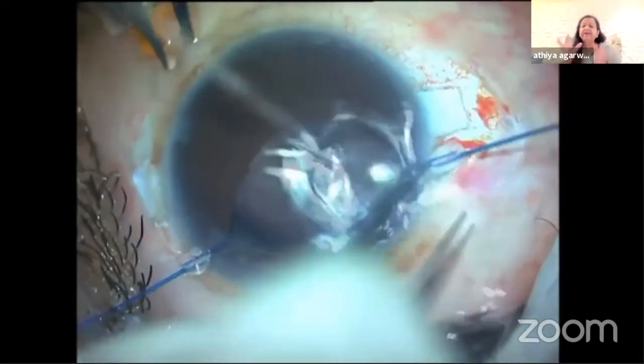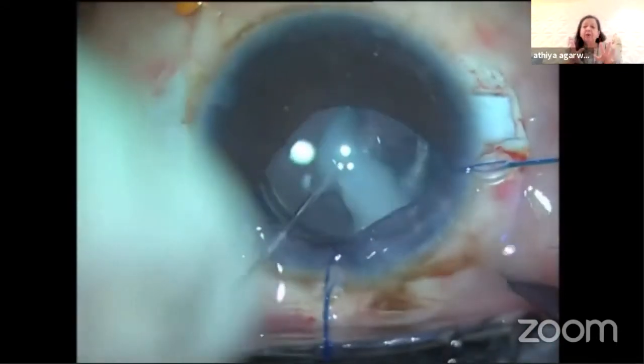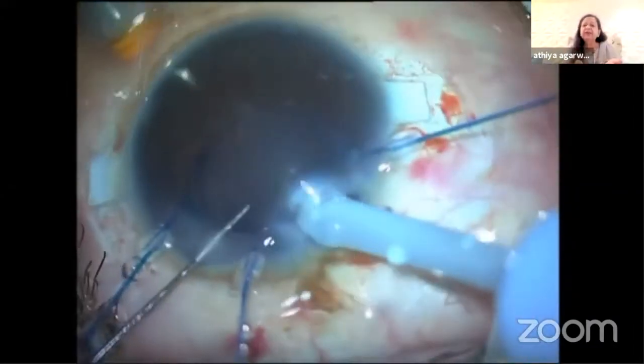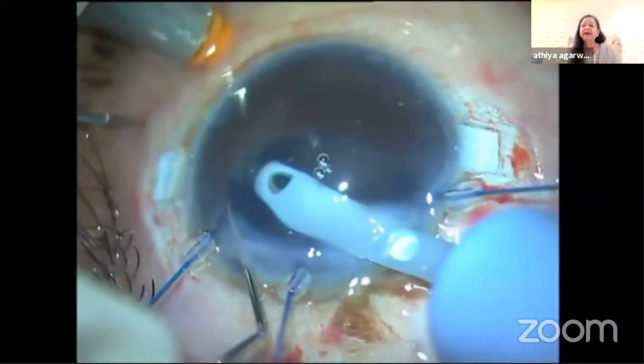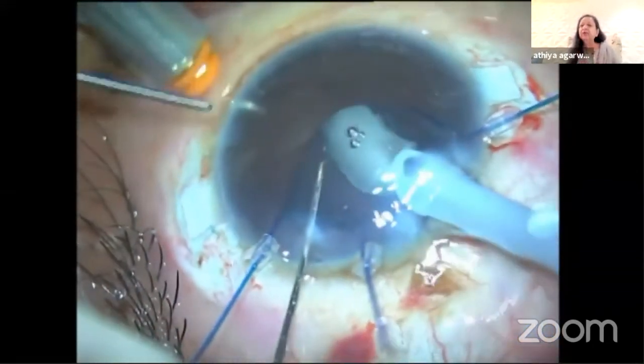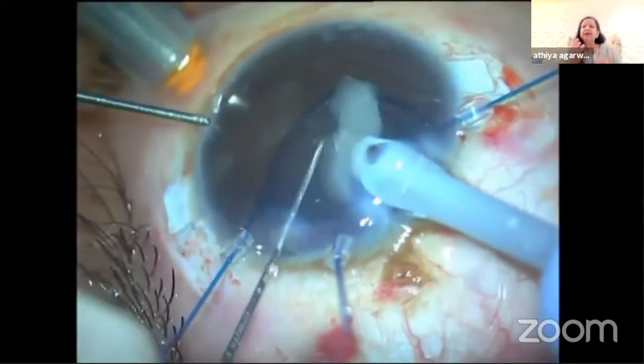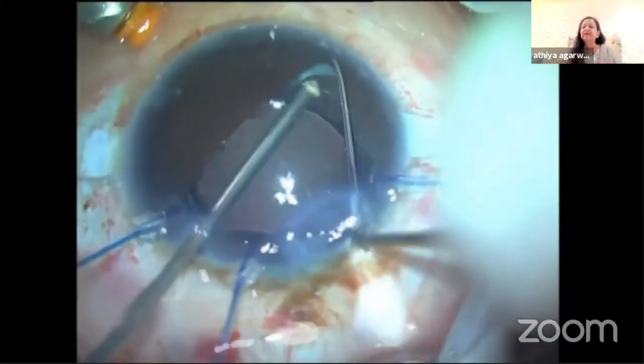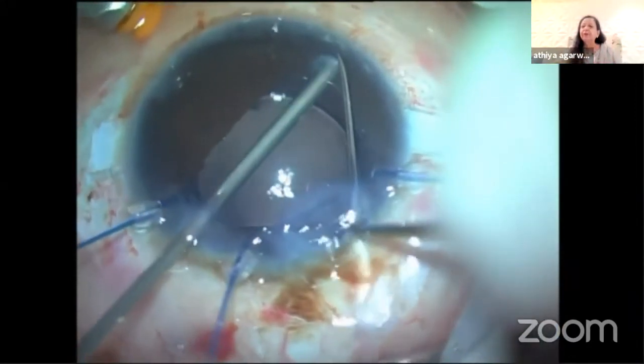The idea is I have created a platform of my own to see that these rings do not fall into the vitreous cavity. Without this support, if I do this, it would go behind the iris, but the lens is there to hold it on. So scaffold is nothing but you create your own platform so that these segments do not fall behind.